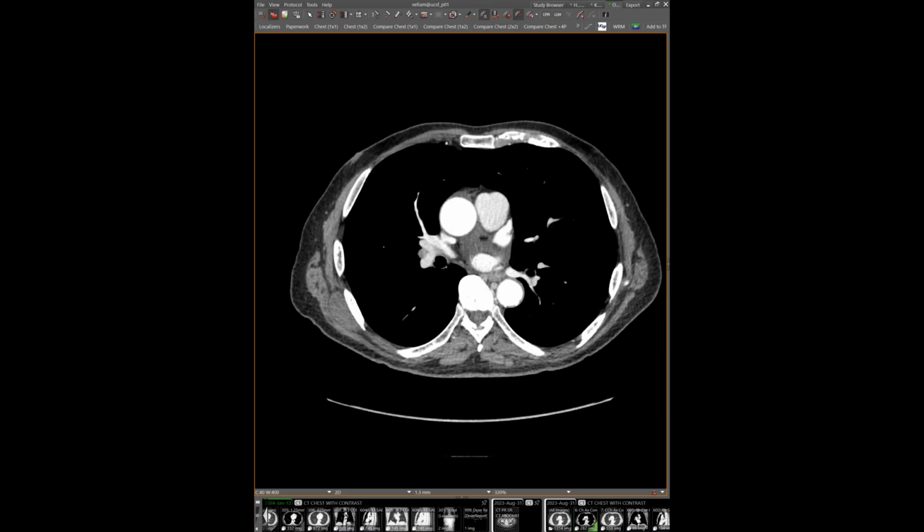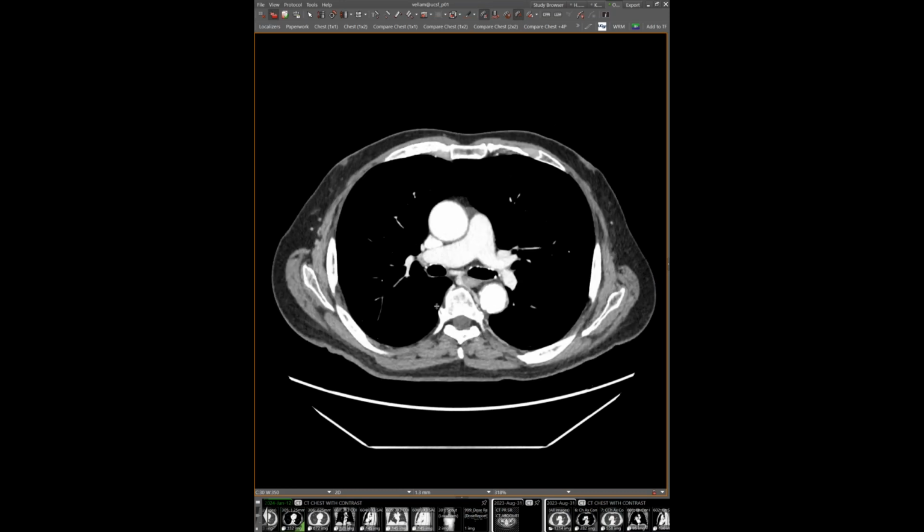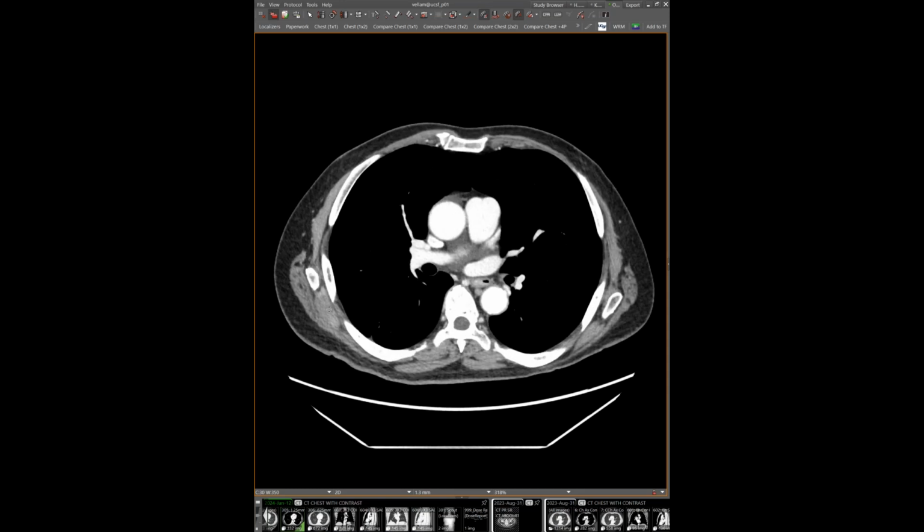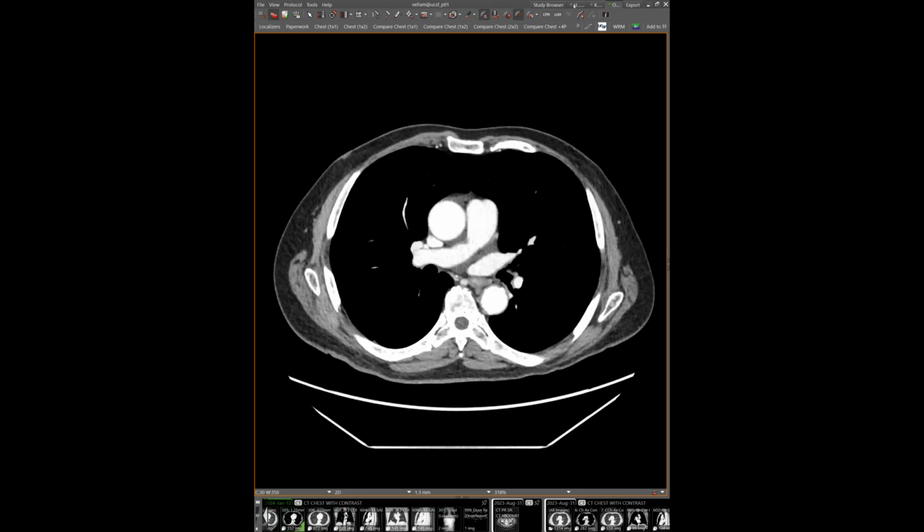And then they got treatment. They were started on a new or different immune therapy and it did shrink back down. So again, that suggested that this is actually just a met. Just a very sneaky one.